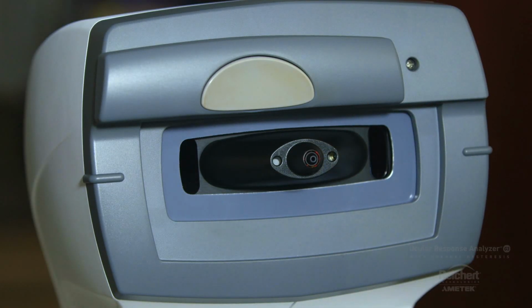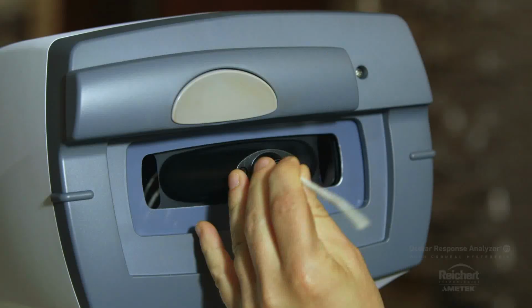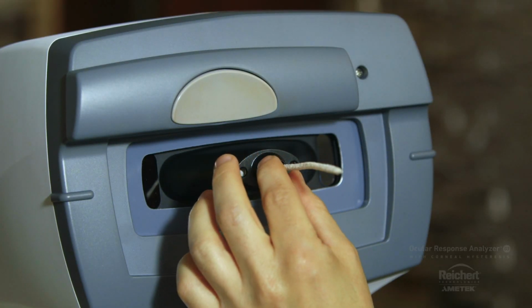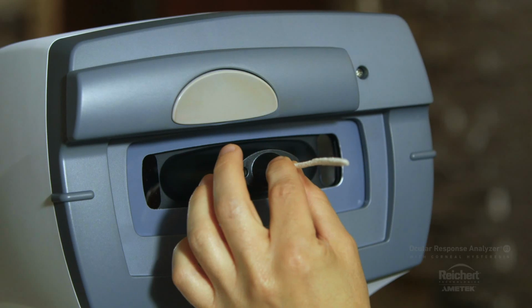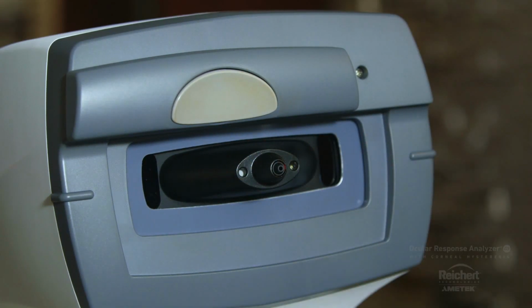Finally, for the air tube itself, that's what the pipe cleaners are for. You're going to take a pipe cleaner and you're going to stick it straight down the air tube all the way until you feel it stop very gently. There's a lens at the back there. Try not to contact the lens too hard. And then move the pipe cleaner in and out a few times. This is scrubbing the inside of the air tube, and now you're done.